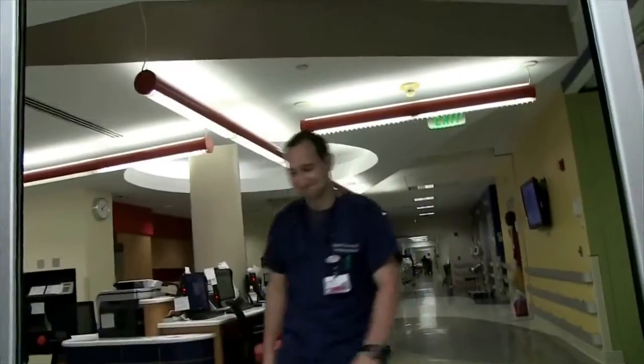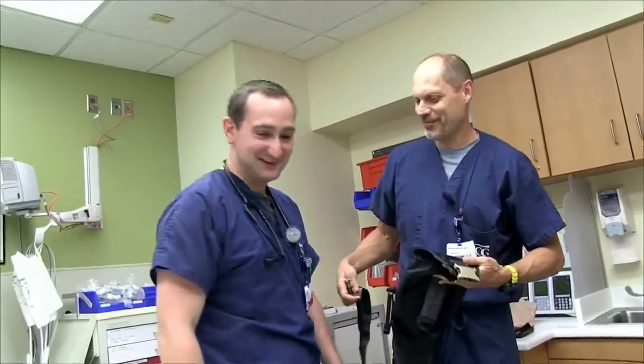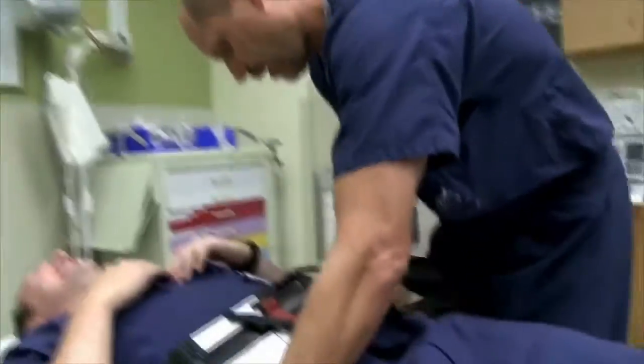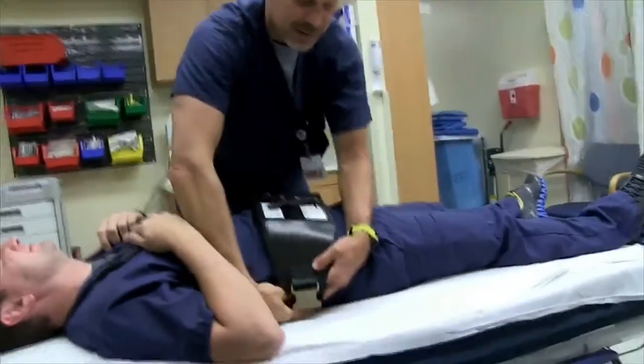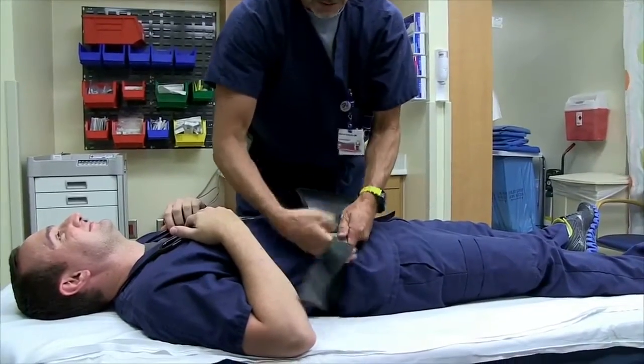I can actually show you how to do the placement of the device in the aortic placement. Are there any residents that have volunteered? Dr. Troncone, why don't you step in here? Dr. Troncone, you're okay with being on YouTube? Of course. This is all voluntary. To place the device, you run the device under the casualty, and then it has a snap buckle that will be tightened.